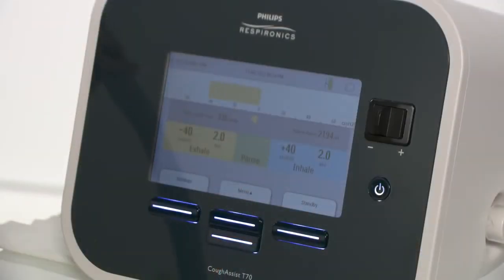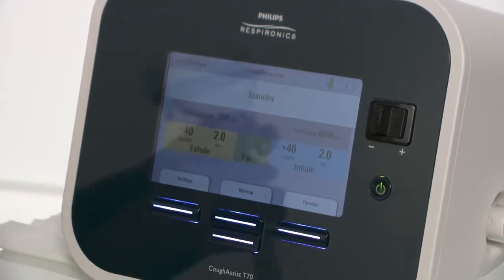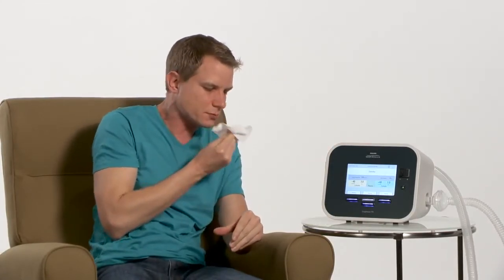CoughAssist T70 will do it for you and display the pressures in real time. Here again, the patient should actively inhale and exhale. You can pause the treatment at any time by pressing the right button under Standby. After the treatment, clear any secretions from his mouth, tubing, and patient interface.